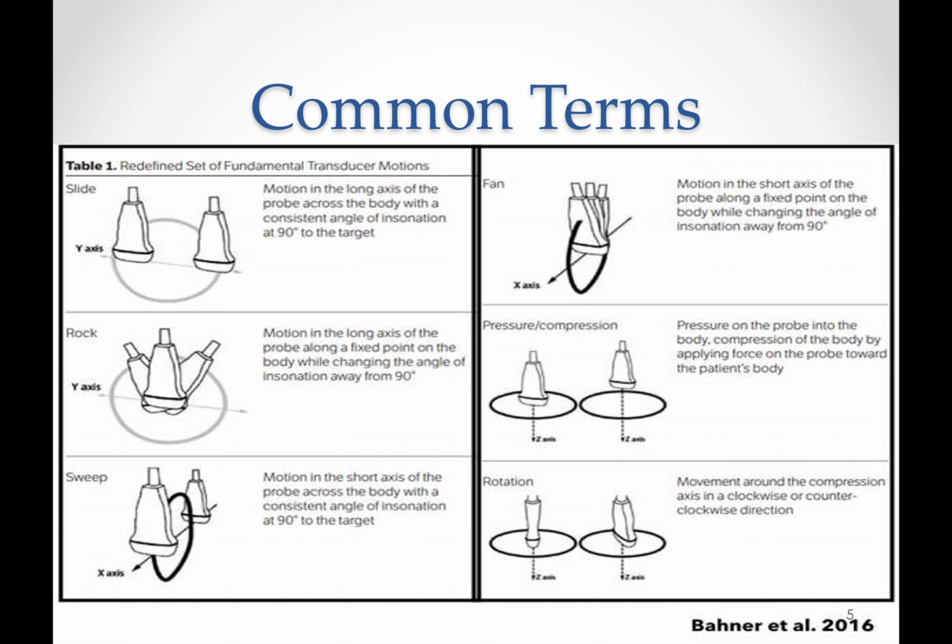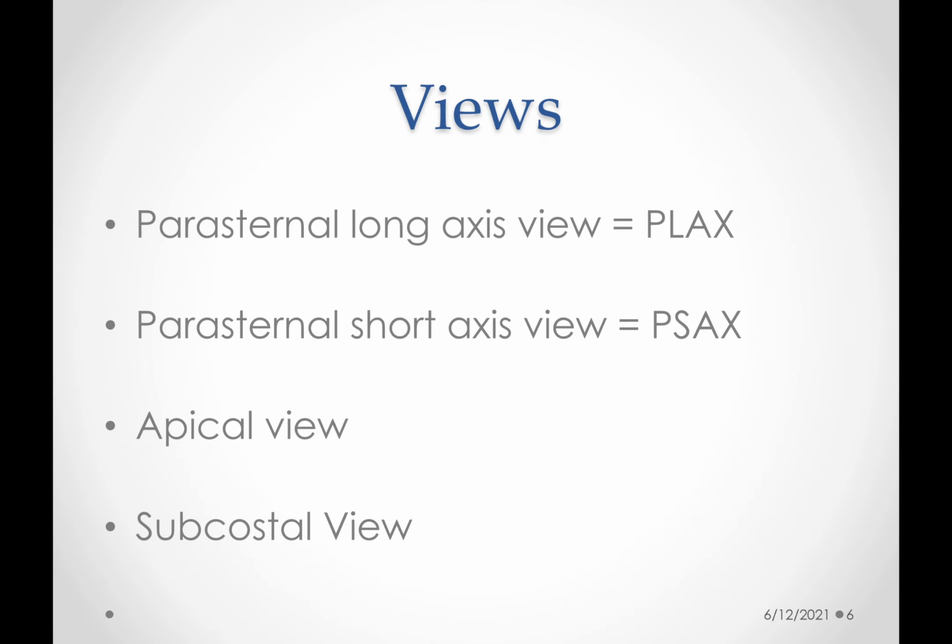These are common terms that we use while doing any type of ultrasound: sliding, rocking, sweeping, fanning, compression, and rotation. We'll talk about 4 basic views, which are the parasternal long axis view, parasternal short axis view, apical or 4-chamber view, and subcostal or subxiphoid view.